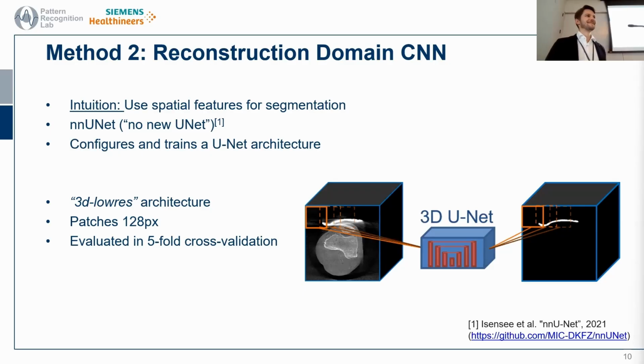Thank you for your presentation. I was wondering, so one of the main reasons to not use image-based segmentation with metal artifacts is for the case that the metal is outside of the field of view. Do you think that your method would also work for those cases? Yeah, so that was also one of the motivations why we decided initially to look at projection domain segmentation.